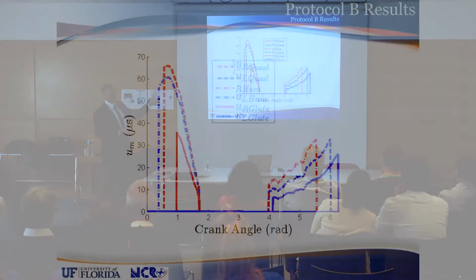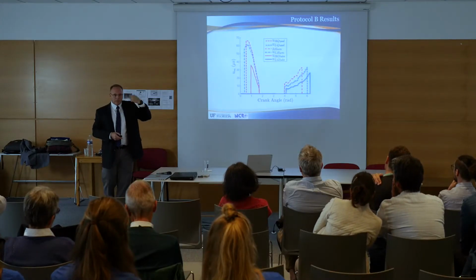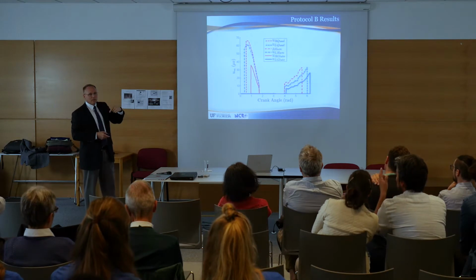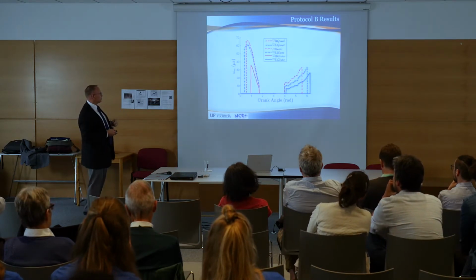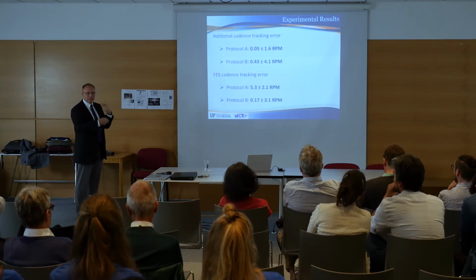And here you see the very asymmetric response by this person with Parkinson's disease. The shapes on the right kind of look like the shapes that were for the healthy normal. The magnitude is smaller because they had the volitional contribution as well, but the shapes on the left are very different. And this was a result of the controller determining when to cut on for this individual in order to yield the right response. So that was kind of interesting, that it could see, it produced this asymmetry in order to yield the cycling motion.